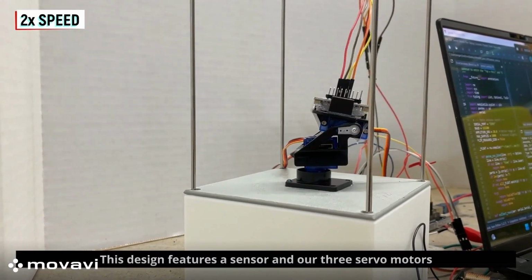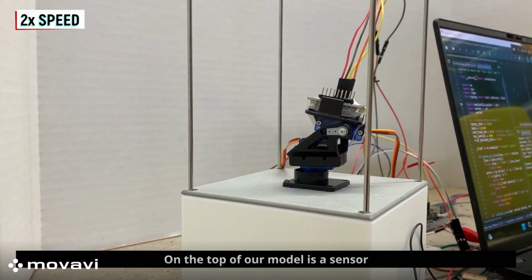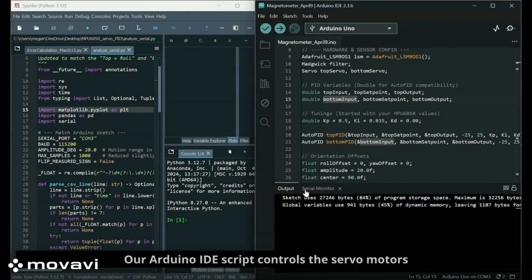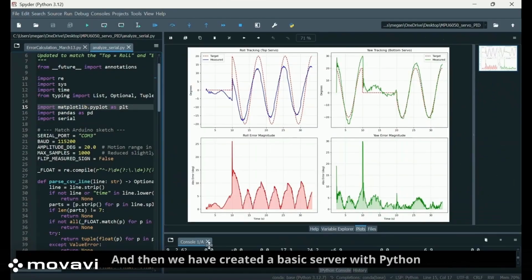This design features a sensor and our 3 servo motors to achieve accurate movement with 3 degrees of freedom. On the top of our model is a sensor with an accelerometer, gyroscope, and magnetometer. Our Arduino IDE script controls the servo motors through the Arduino Uno. And then we have created a basic server with Python to communicate with IDE to store and process data.